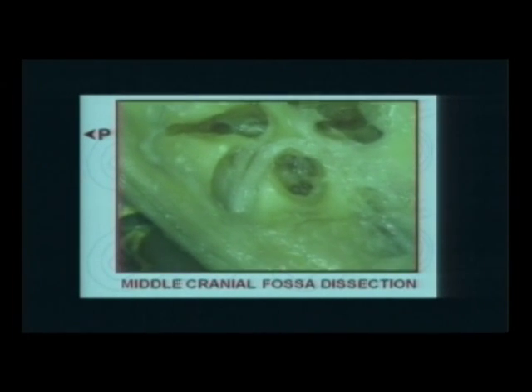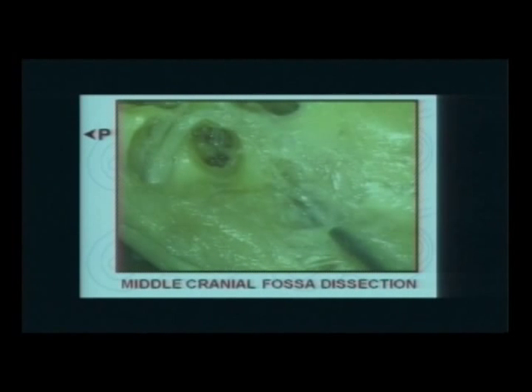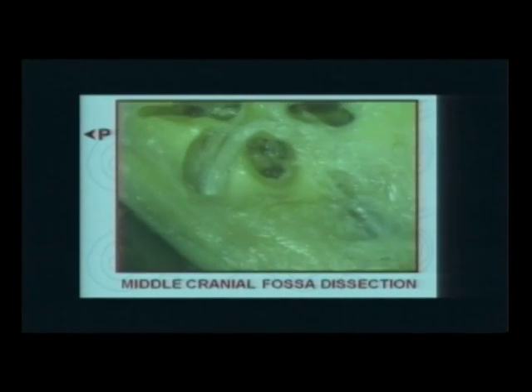This is all the way down to the tip of the mastoid. Okay? This is the lateral semicircular canal, the head of the malleus. This is all the way anterior. You're going to see the middle meningeal artery. When exposing the middle cranial fossa approach, you are actually working between three major bloody structures: the middle meningeal artery, the superior petrosal sinus, and medially you can also reach the area of the sigmoid sinus.